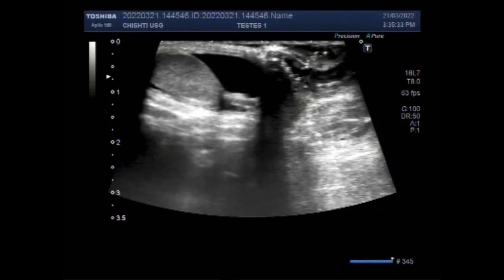Dear viewers, I hope you are all fine. This ultrasound video shows a case of inguinal hernia in a child of 9 years.